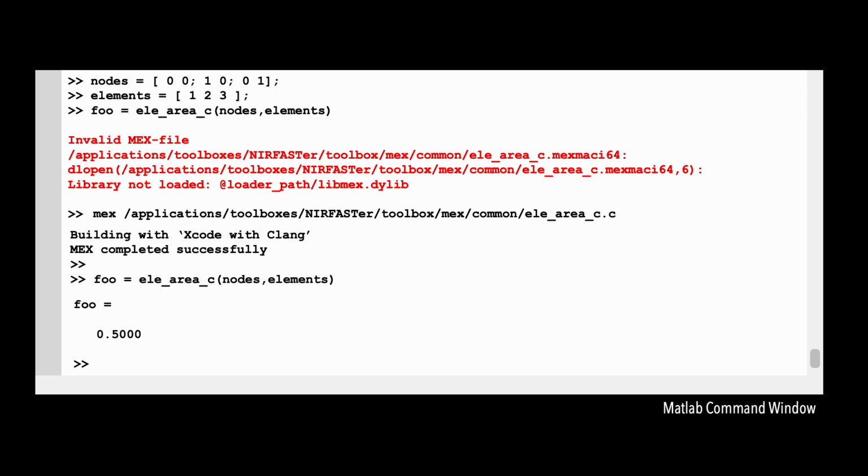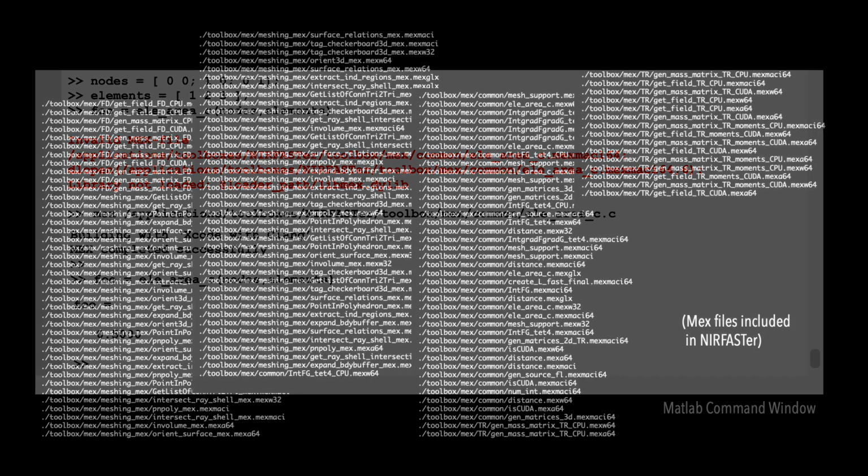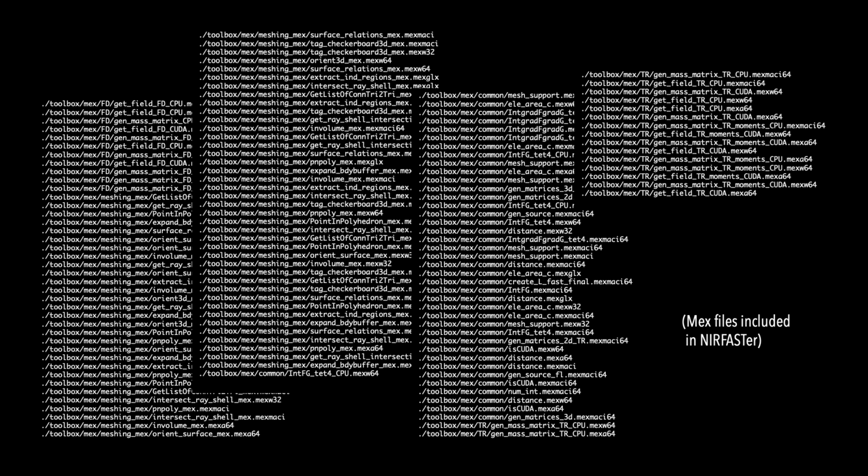customization of configuration files. Additionally, if the entire code base is affected, individually recompiling all of the source files in a distribution is tedious at best. Some third-party toolboxes include makefiles or other scripts for this task. Currently, however, NIRFASTer does not. MathWorks provides extensive documentation on use of the MEX compiler. If you encounter MEX issues and are unable to resolve them, the NeuroDOT development team should be able to help.